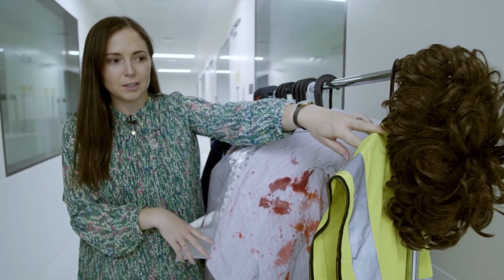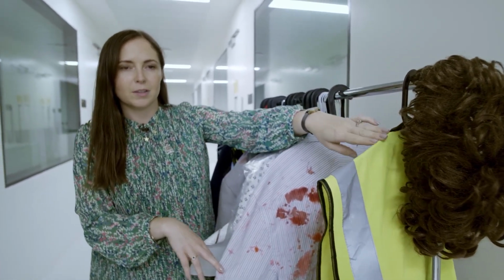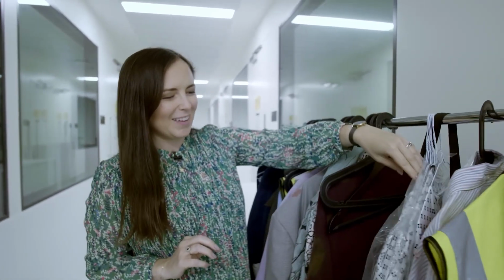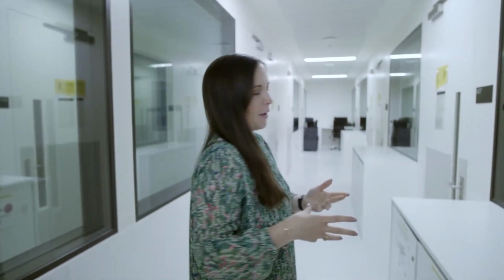We have an electrician who comes in and has been thrown back, so it's quite important that a full assessment is done. They find the bruising on his back or her back, things like that. And then we have surgical gowns and lots of different things for different scenarios, so that our mannequins feel like real people where real things have happened.